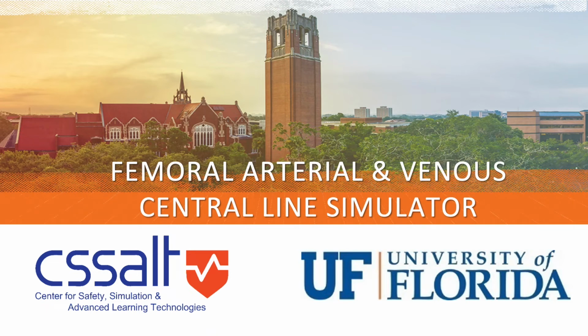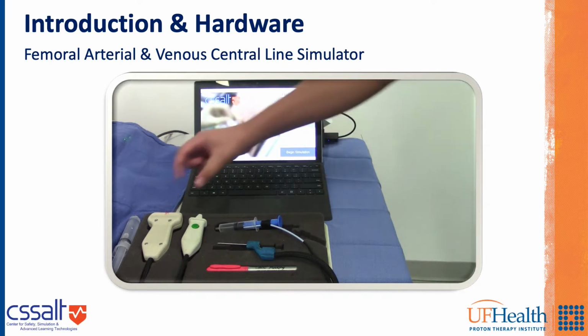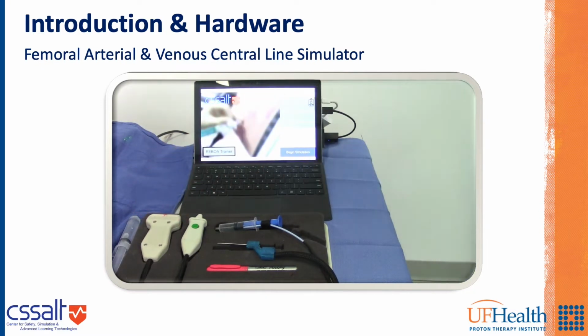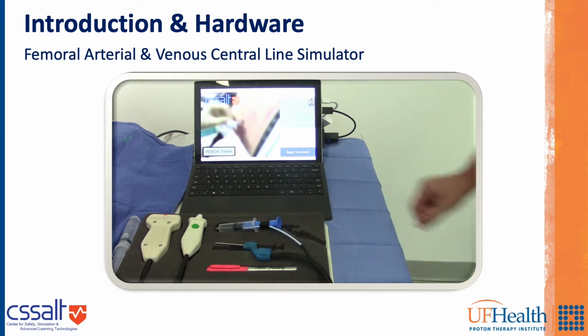This video presents the Femoral, Arterial, and Venous Central Line Simulator developed by the Center for Safety, Simulation, and Advanced Learning Technologies. This simulator was developed using the SMARTS Rapid Simulator Development Platform. The simulator has three major components, including the anatomical block and stand, the computer and screen, and the track tools, which are the ultrasound probe, access needle, and virtual camera controller.